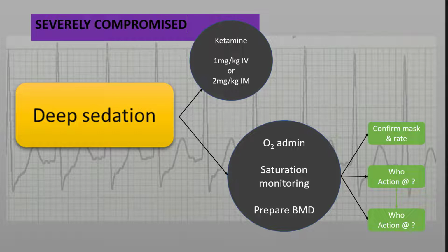If the answer is no, the inference is that there's a life-threatening hypoperfusion going on, that the patient is in the peri-arrest phase, and that cardioversion should be delivered without any further delay. If not, that is to say the patient is severely compromised but can obey a command, then sedation is the appropriate course of action to take prior to the cardioversion. And at this time, the expectation is to use a fast-acting dissociative agent such as ketamine.